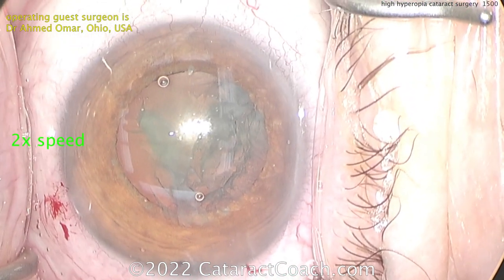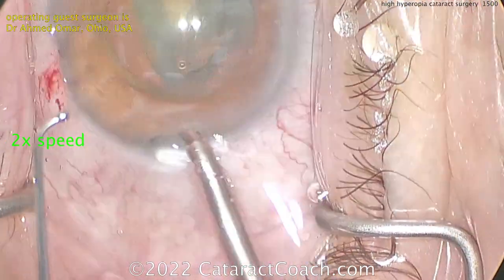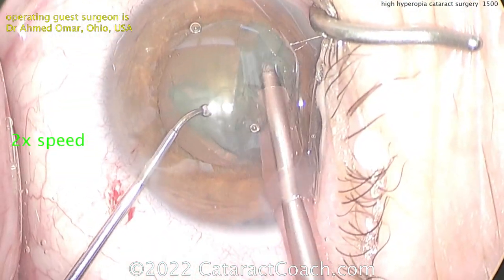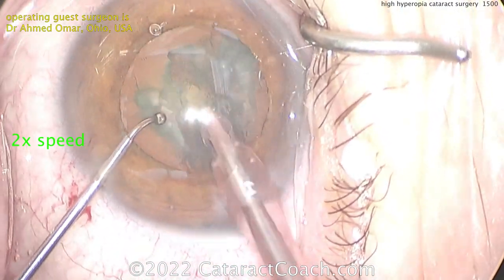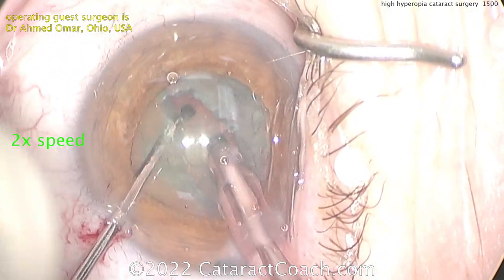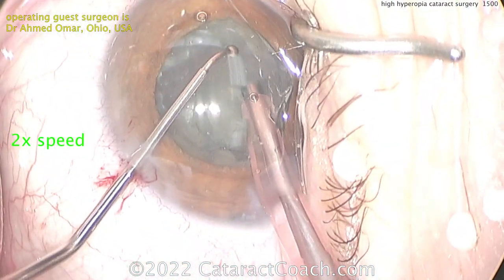Here comes the phaco probe. In a case like this, you want to operate within the capsular bag. A nice technique here is to do a stop and chop, because you can de-bulk the central nucleus. I'm watching the technique for the first time with you. Cleaning up here a little bit — a nice groove down the middle, a nice central groove. That'll help to de-bulk the nucleus. And now it is a stop and chop, in fact. Good choice there.